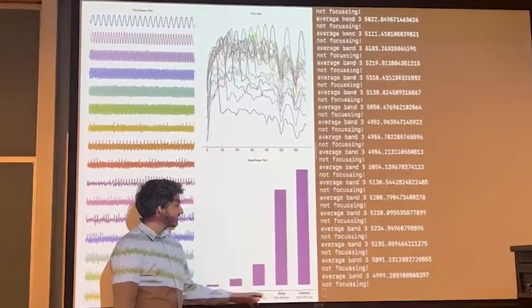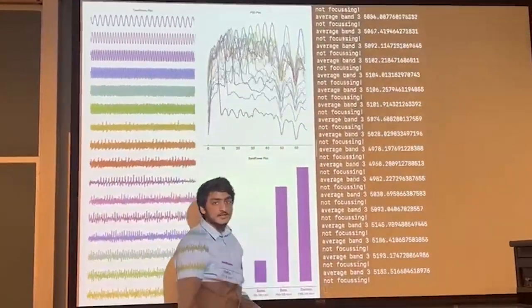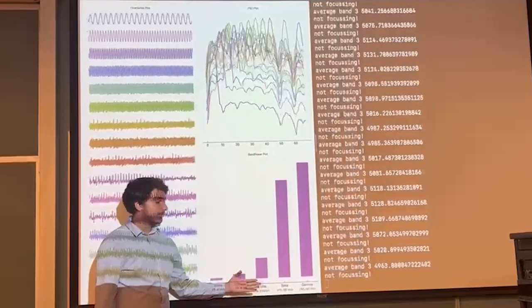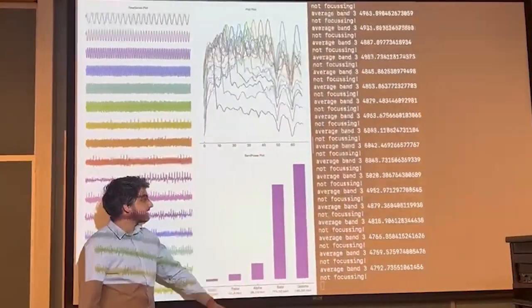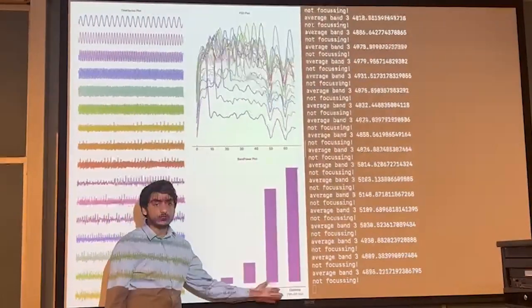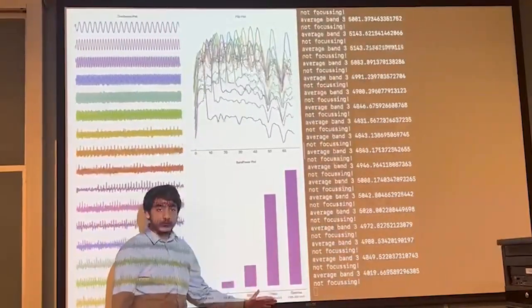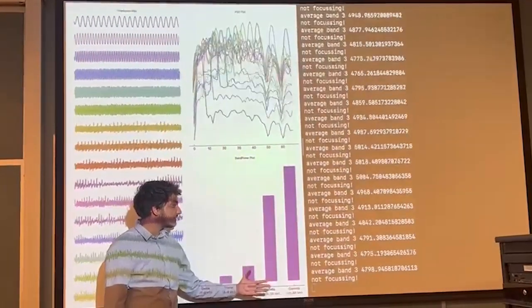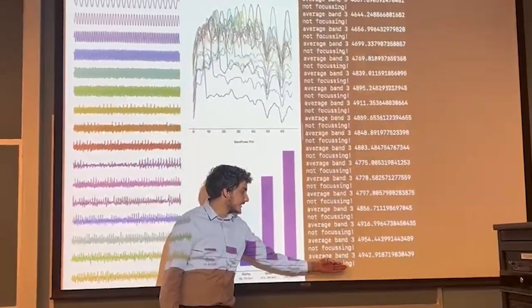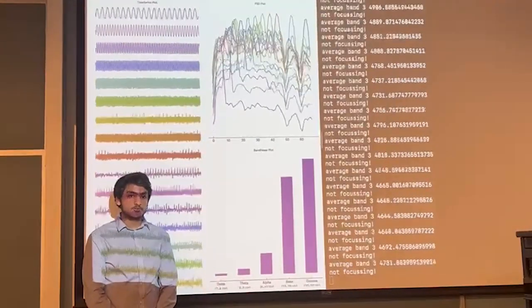So we decided to print out the raw values for these bands, which you can see over here. We decided to create a threshold-based classifier that can identify when exactly these bands are up and when exactly these bands are down. Our program looks specifically at these three bands, and when the user is focused and the beta wave is high up and these two are fluctuating, it captures that and classifies that as focusing. When these three are going haywire, as when the user is not focusing, it classifies that as not focusing, which as you can see is represented right over here, along with their corresponding values. As such, we're able to classify focused and unfocused user behavior, and our project works using that.